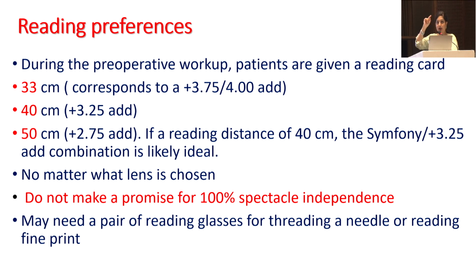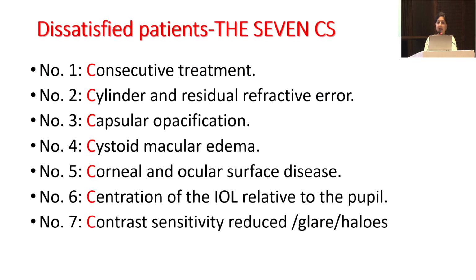But what is important is, at what distance the patient's maximum work is going to be. You probably have to actually measure it, and then you are sure that whatever lens you're going to use is going to be fine. No matter what lens is chosen, do not make a promise of 100% spectacle independence. And yes, just touch upon the dissatisfied patient.